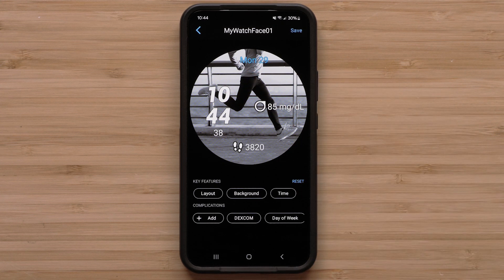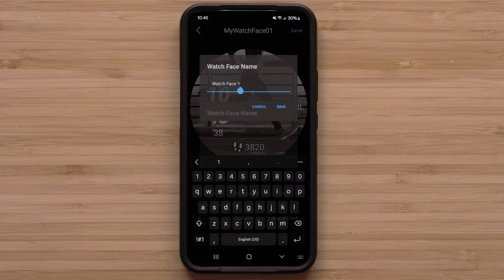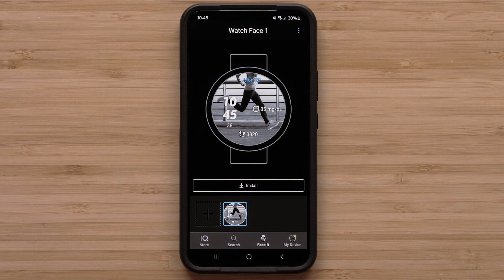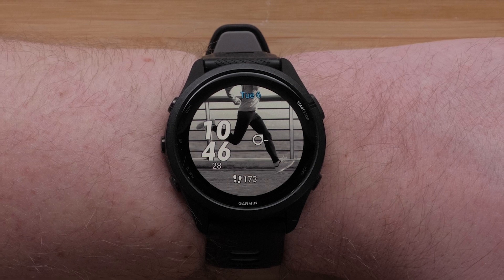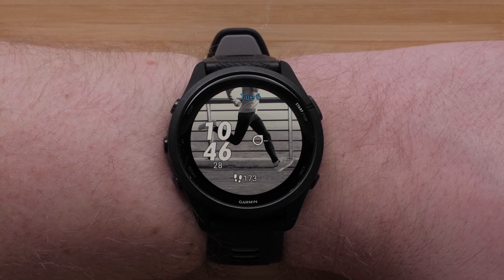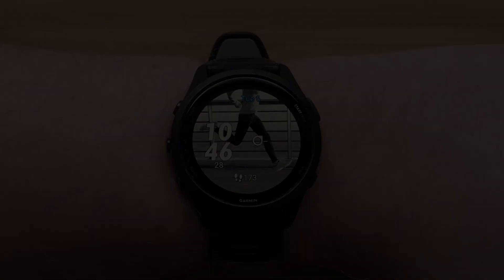Now you can continue customizing the complications on your watch face, or select Save when you are done customizing. Name your new watch face and select Save. The watch face is now ready to install to your watch. Select Install, and the watch face will then sync to your watch. And that's it — you can now create custom watch faces that include Dexcom complications using FaceIt in the Garmin Connect IQ app.